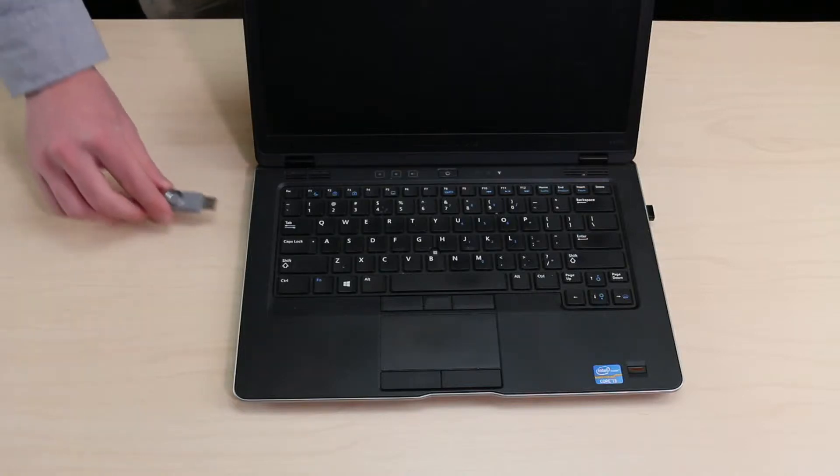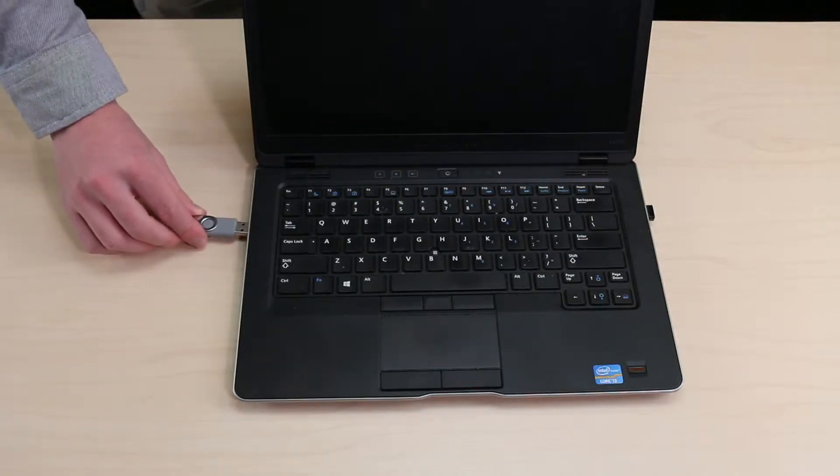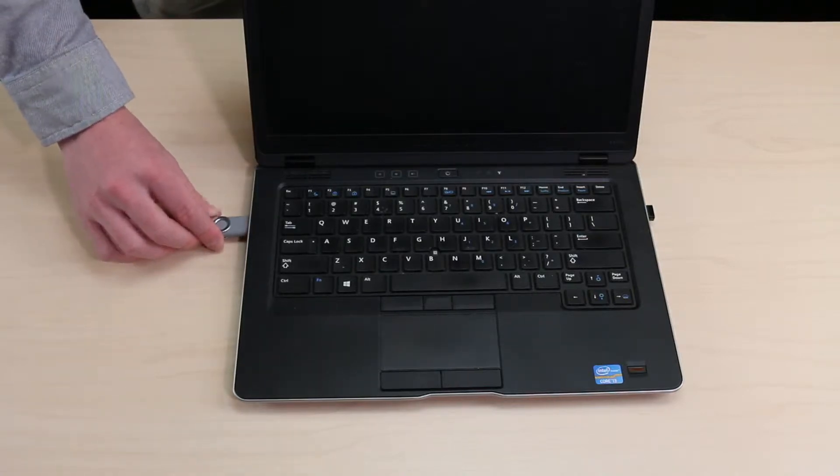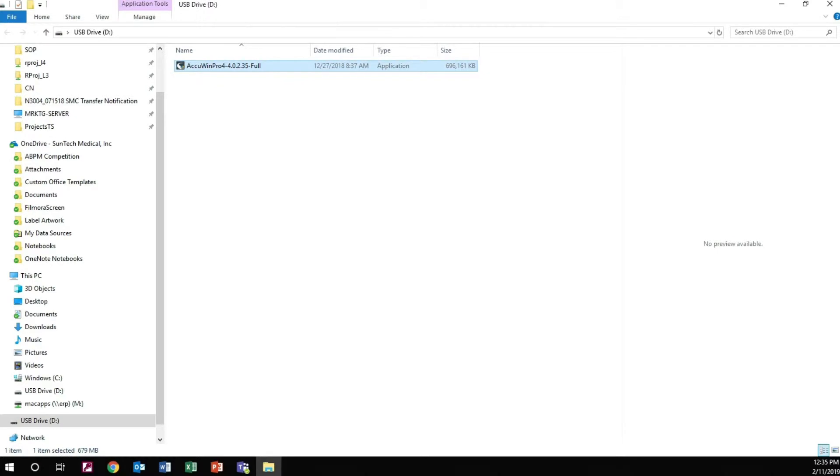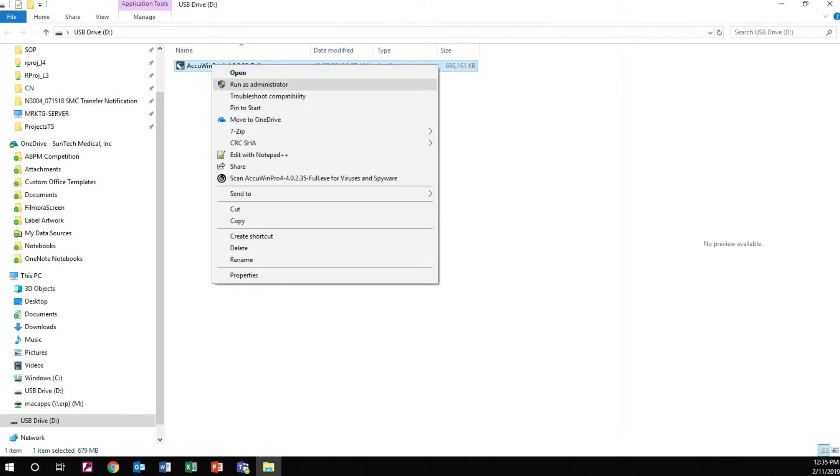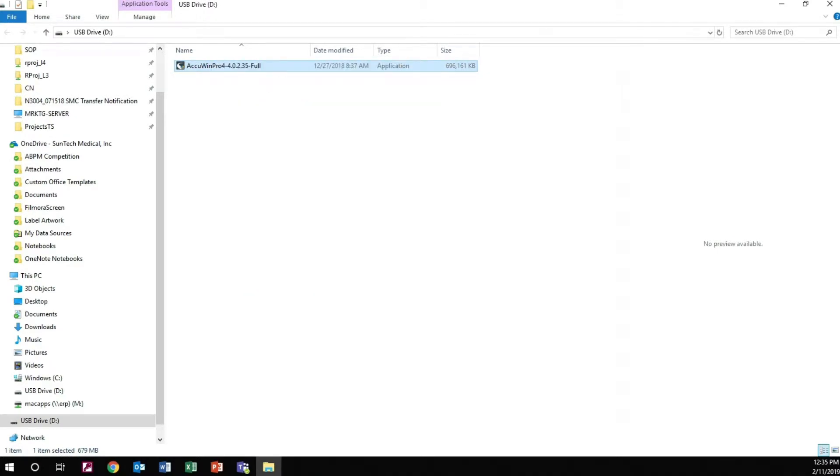To begin, first plug the USB stick into the computer. Open the contents of the USB from the File Explorer.